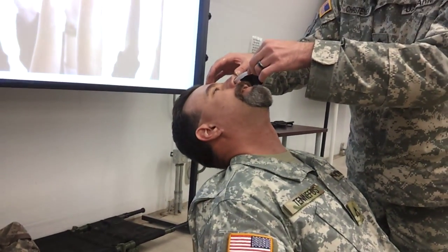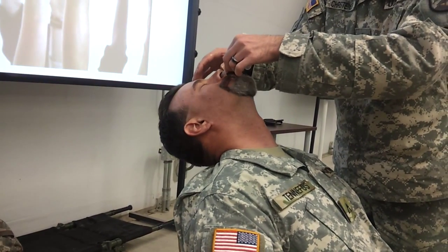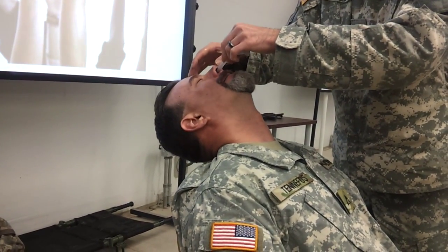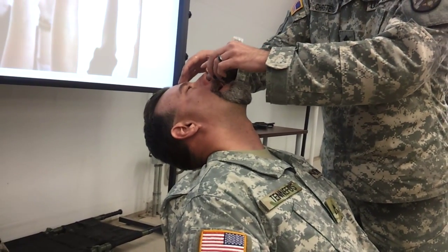Swallow, please. There we go. Is it too much? No, it's not working right now. There we go. How was you scraping this tight thing? There we go.